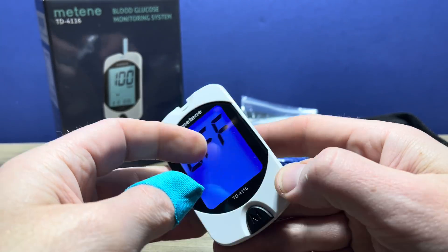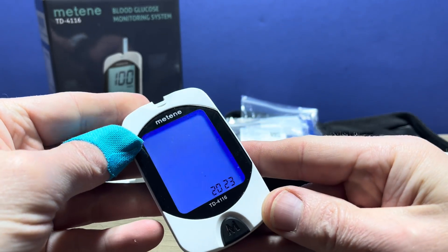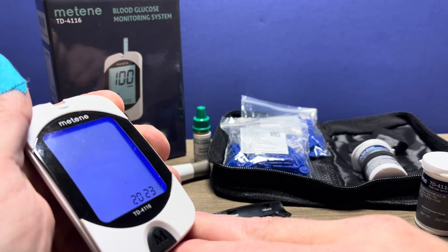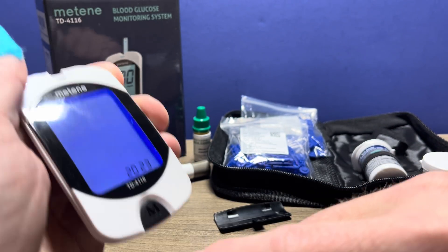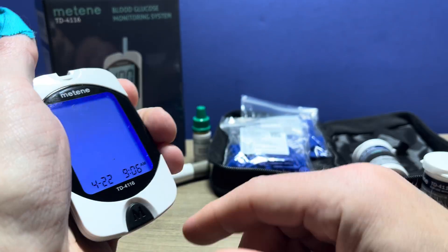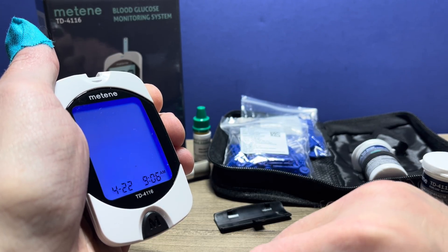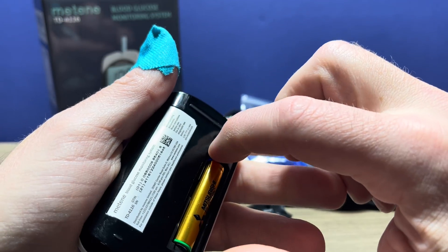Press the set button until it beeps, and then the first option is the year. The year is correct so I'm going to press the set button to go on. If you want to adjust the year you can press the M button. Press the set button again. Now we're on to the month. If the month is not where you want it, you keep pressing the M button until it is to your desired setting. Press the set button.